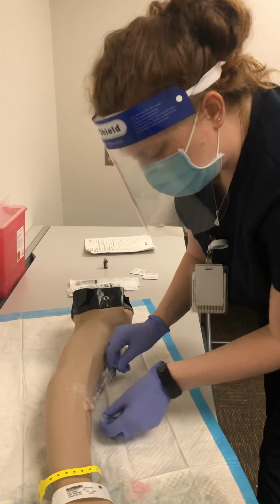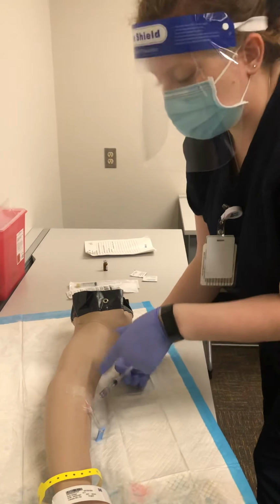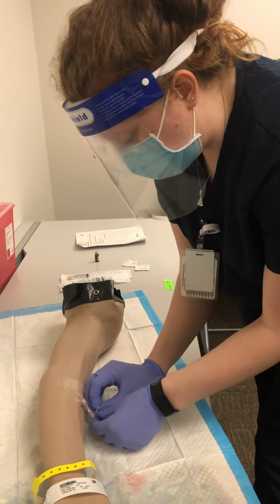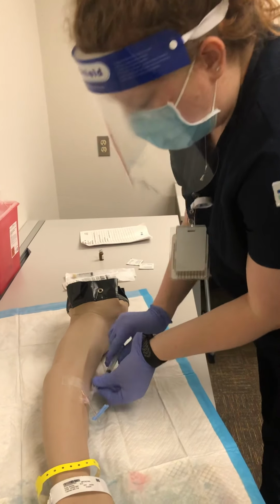And that would have been locked, and now I'm unlocking it. So we are flushing it, 3 mils, watching for infiltration. She's going to tell me if she's in pain from that. Okay, so now we are locking this and disconnecting from the port.